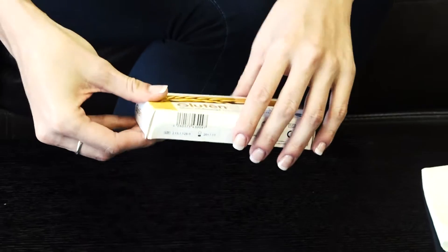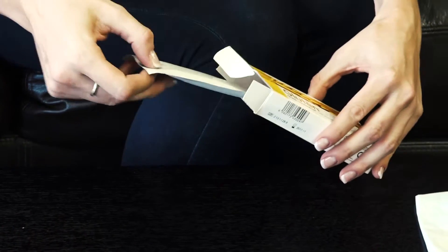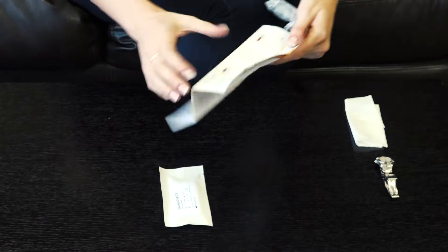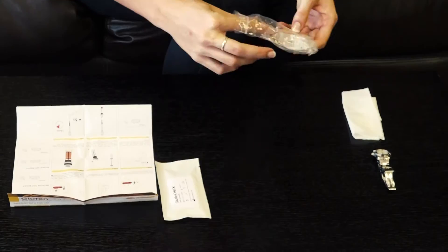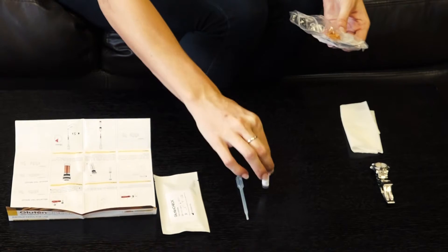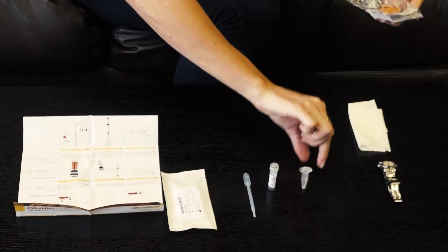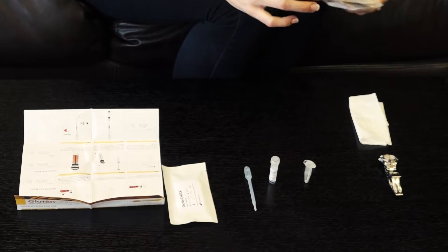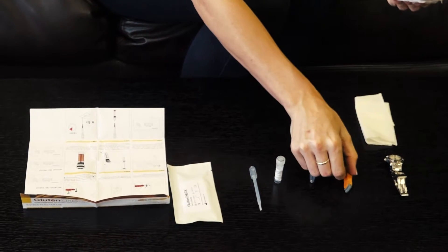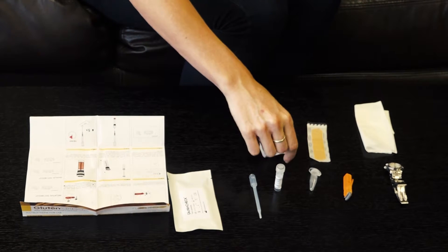Step 2. Open your Gluten Check Pack and place the contents on a clean table: one test cassette in a sealed pouch, one instruction pamphlet, one pipette, one glass capillary tube in a protective container, one solution bottle with sample dilution buffer, one automatic sterile lancet for comfortable blood sampling, one plaster, and one alcohol pad.